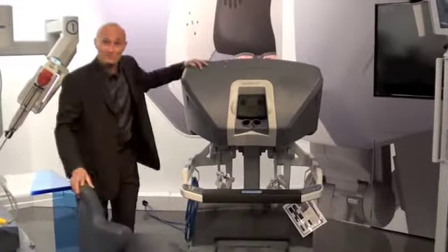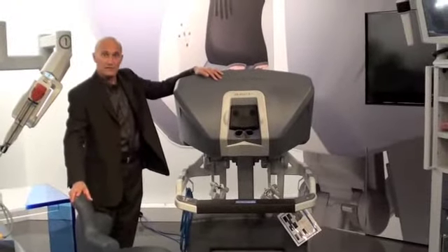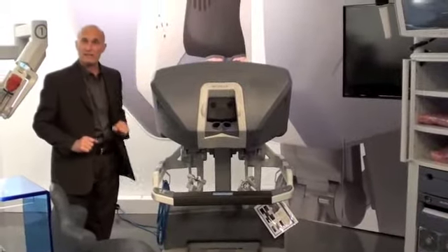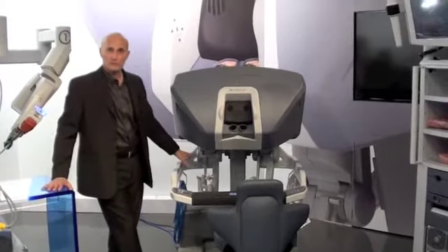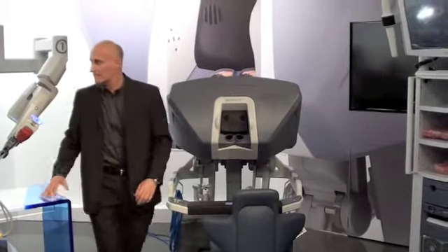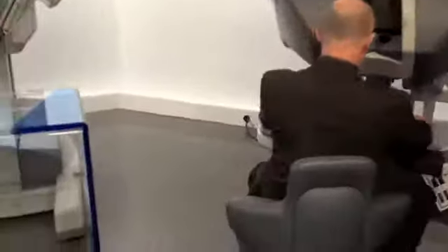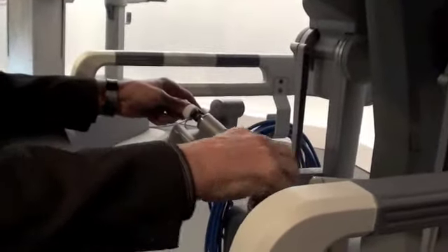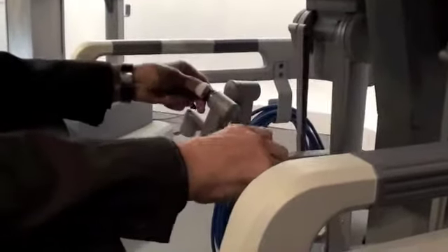This is the surgeon's console, and this is customizable to a physician. They put their name in, and the height, angulation, and armrests are placed precisely to their specification. The master controllers translate the surgeon's movement precisely and instantaneously to the patient cart. The controllers of this system, you can come in here, are these controller arms. The physician puts their head within this vision system. I can see a binocular vision, and I'm able to then move my instruments.